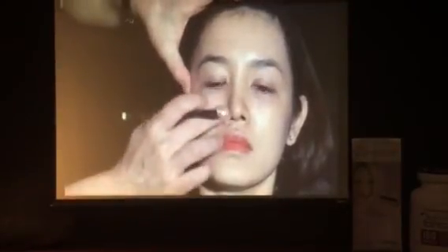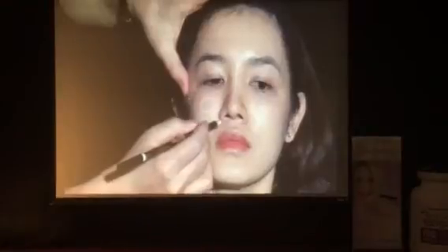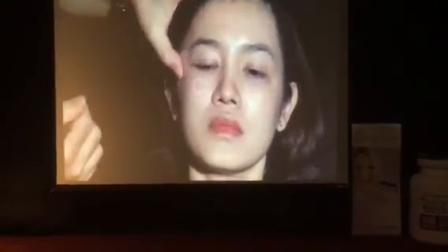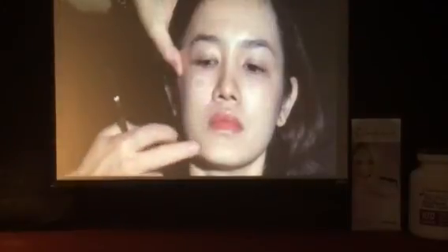And for her, we also need to do the L4 area, the canine fossa area, to give her support. So I will do this 8-point lift. We use the product Voluma. We wanted a more lifting effect, more supporting effect.